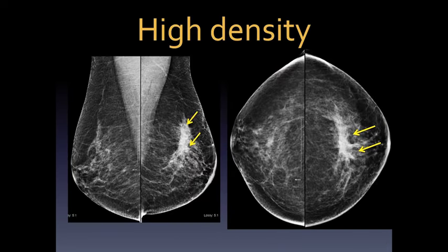Fine linear branching is the most worrisome morphology for calcifications — they correspond to the ductal pattern where malignancy is forming in the ducts, not in the acini. The most suspicious features for calcifications are fine pleomorphic and fine linear branching, with other descriptors being less likely but also associated with malignancy in a smaller number of patients.